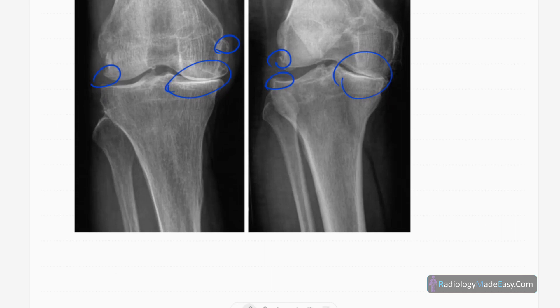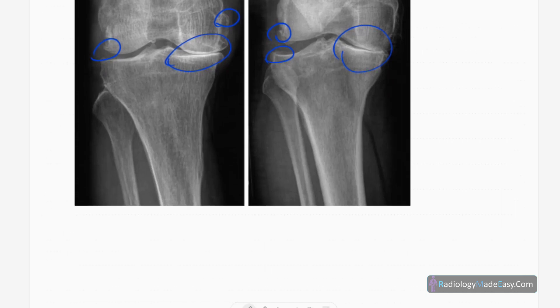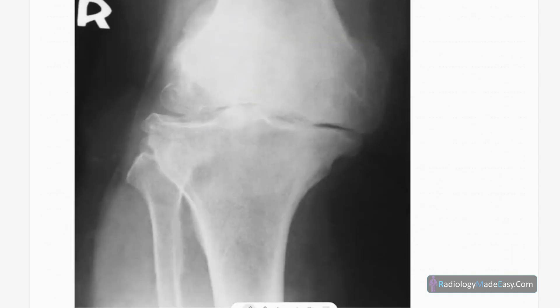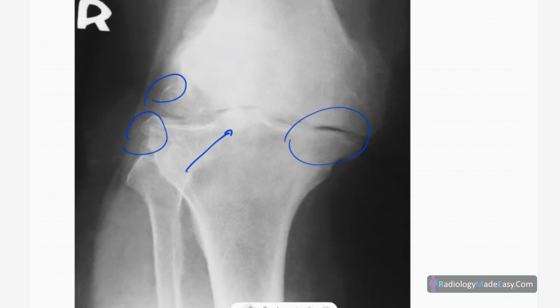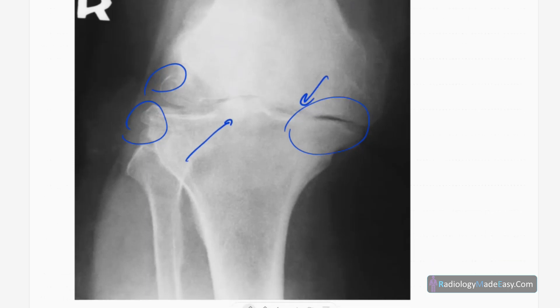This is a stage four disease. You can see deformity in the joint, marked joint space narrowing with almost absent menisci, degeneration of cartilage, large osteophyte formation, and subchondral sclerosis — a classic stage four presentation.